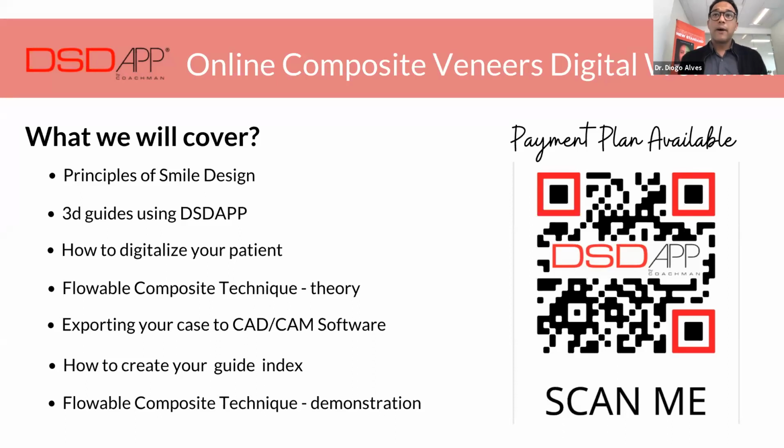That's a course where we want you to understand the entire workflow. We want you to understand the principles of digital smile design. How can I become a digital smile designer? How can I actually take that design and bring it to reality, knowing that the patient actually knows how the procedure works and what the final outcome will look like? By giving you that, one of the benefits is that you will be in control of the entire project.